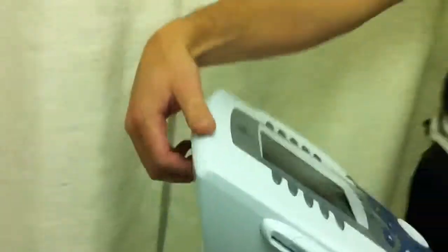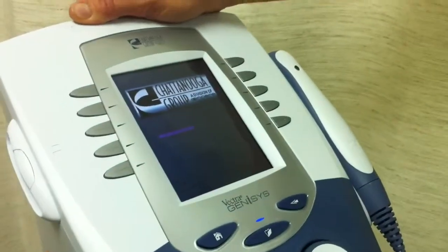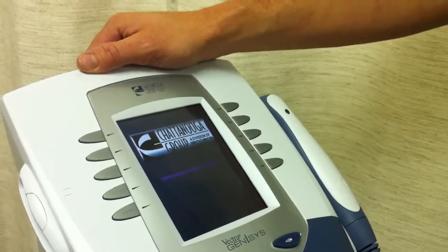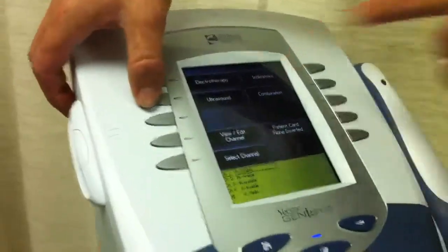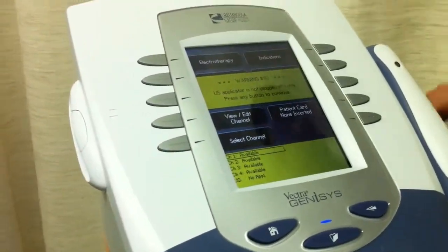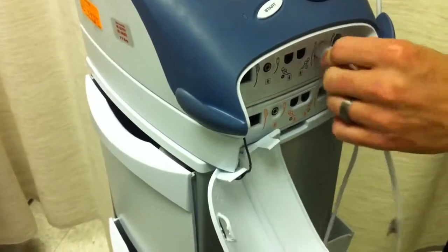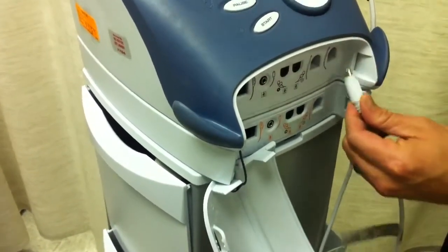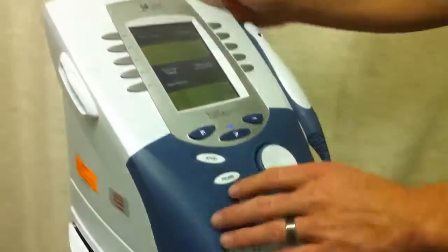We're going to go ahead and turn the machine on — there's a lever here in the back. You're going to select the ultrasound here. Apparently someone has unplugged us, but we can plug that in and fix that, no problem. You can't exactly just start the exam right away. All plugged in.